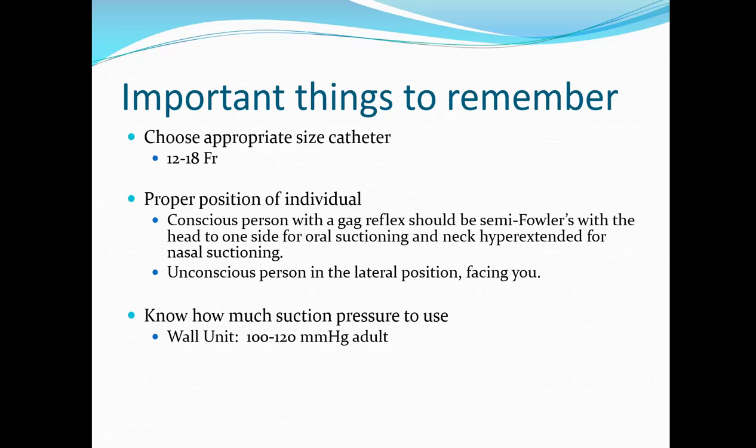If you are able to hyperoxygenate, or give somebody an increased amount of oxygen for that time period while you're suctioning, that is going to be ideal because you are literally pulling air out of their lungs. If they're already having respiratory issues, which they likely are, this is going to be beneficial to them. Okay, and again, never apply suction during insertion.